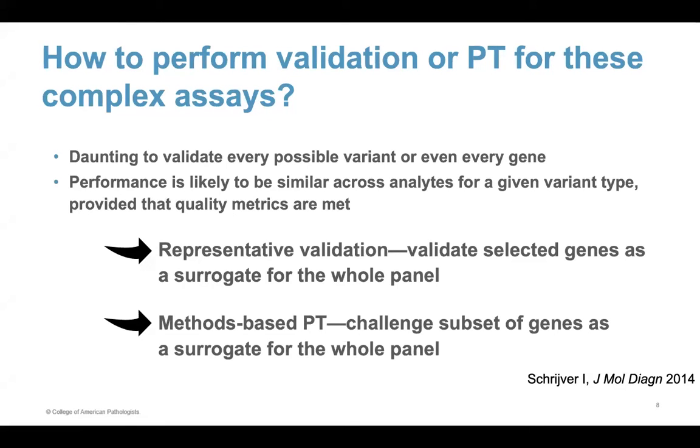The mirror image, or the flip side of representative validation, is what we've come to call methods-based proficiency testing. As viewers will know, it's important to participate in proficiency testing within a CLIA certified testing environment.